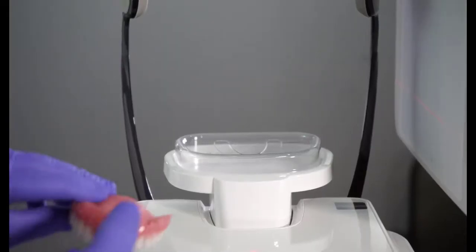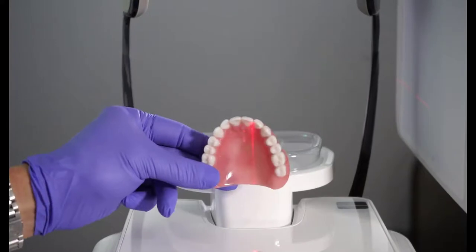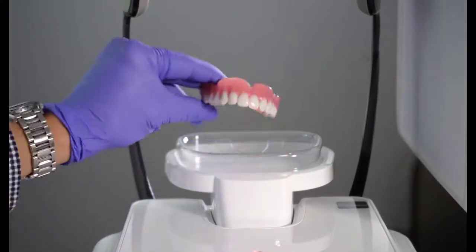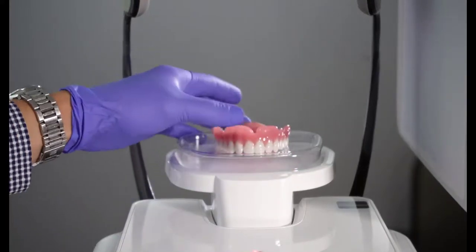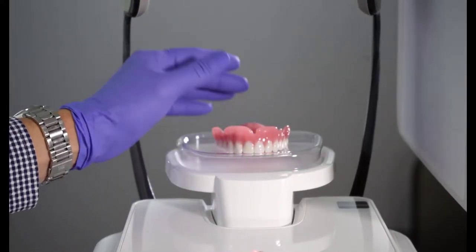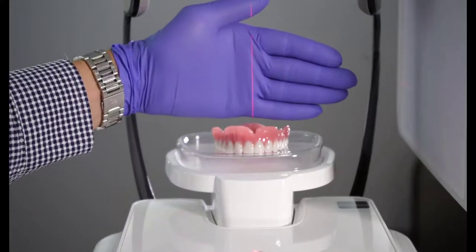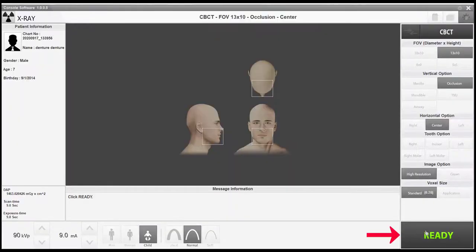Next, place the object to be scanned on the platform and center utilizing the mid-sagittal beam. Next, select Ready to scan the object.